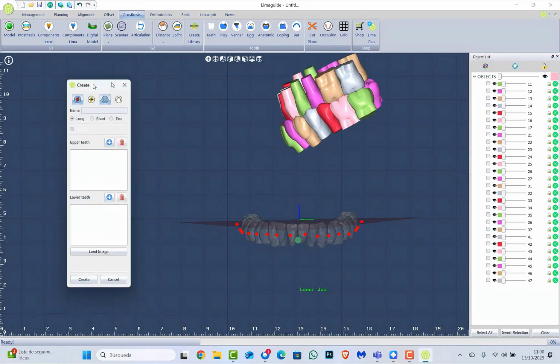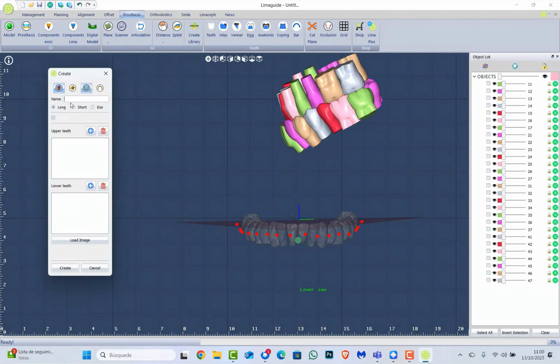Now I'm going to first name my library. I can type the name here. I'm going to name it Kike 2025.